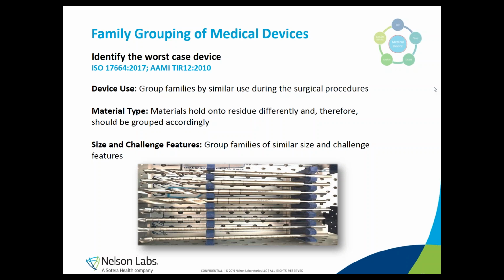Imagine a medical device manufacturer who is making drills like the ones that you can see on this picture. These drills can be very similar in design, with only having, for example, a different length and some small differences in the drill heads. And for this type of devices, it is allowed to group the devices in different families based on a similar use of the device, the type of material they are made of, and also the size and challenging features that are present.